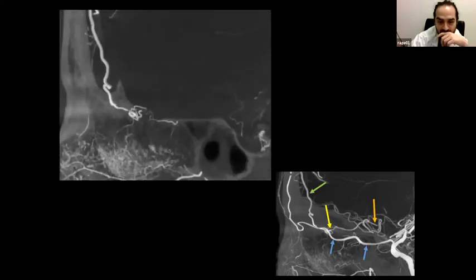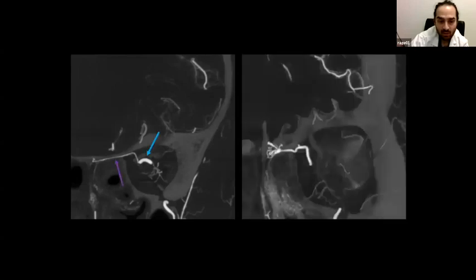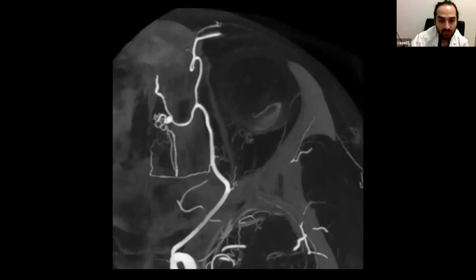You can study this and look at it in different directions. Here it is the anterior ethmoidal artery that connects with the anterior cerebral artery, and here it is the same way. Also, the posterior ethmoidal artery was helping here.